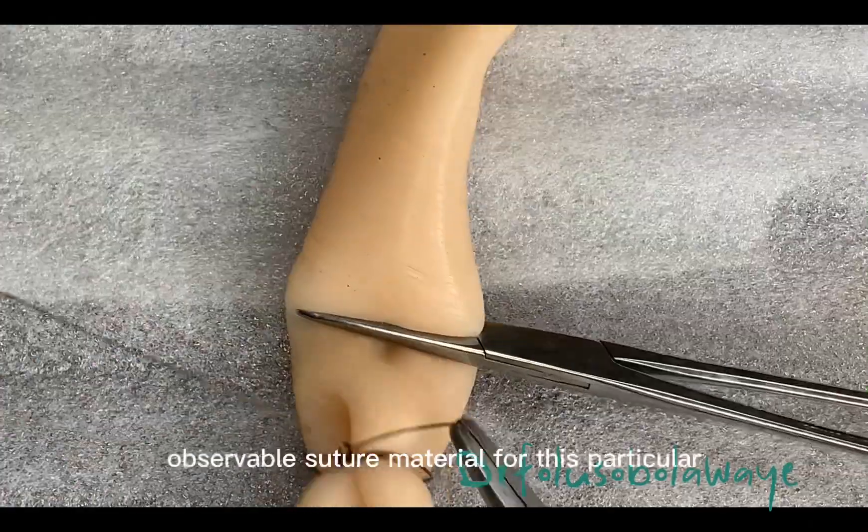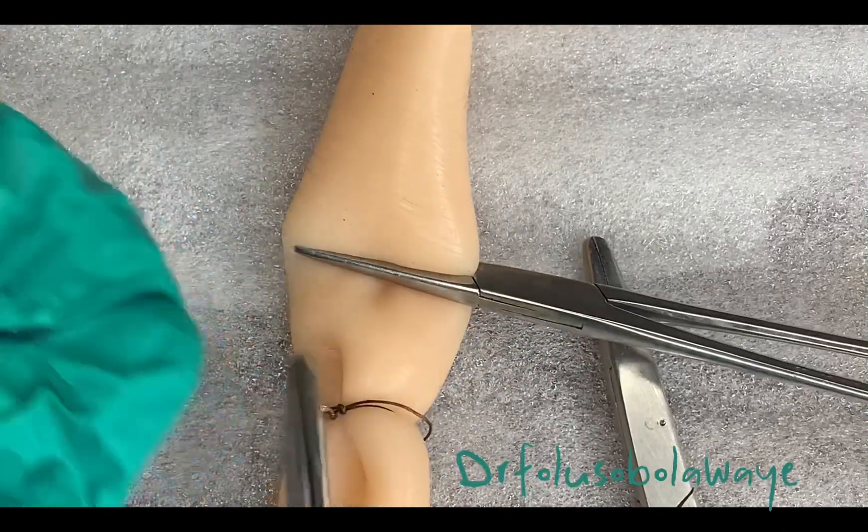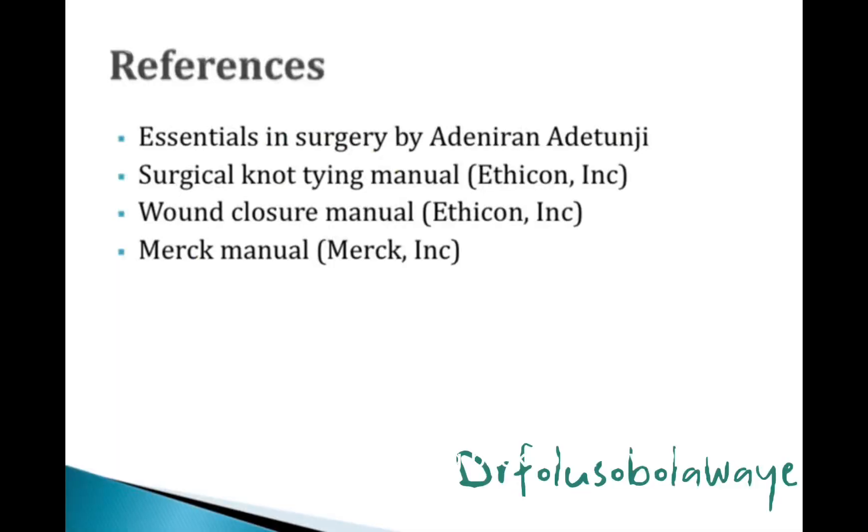Always make sure that you use absorbable suture material for these particular ligatures because you are not going back to remove them.